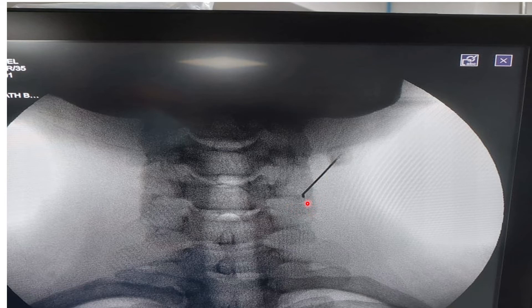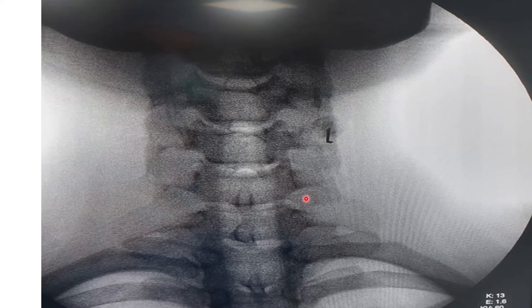After entering, we can see the tip of the needle is slightly more medial than expected. So I have to manipulate the needle to enter a little laterally — as the tip is bent, manipulation is relatively easy. Now I am very happy with the needle position, with the tunnel view needle going in the desired direction.